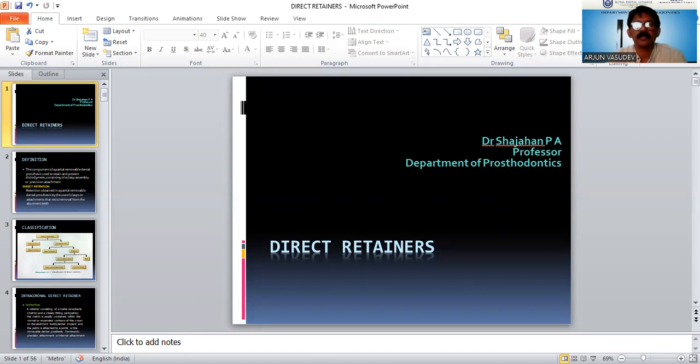And if positioned high on the abutment, it can increase the width of the occlusal table, which can cause greater occlusal forces to be exerted on the tooth. It is also difficult to adjust with pliers. You cannot adjust it with pliers like wrought wire. If you try to adjust it, it might break. Once it breaks, you have to remake it. You cannot do anything on it.